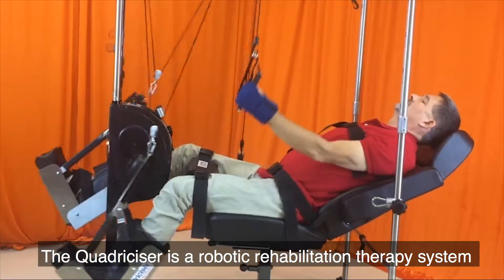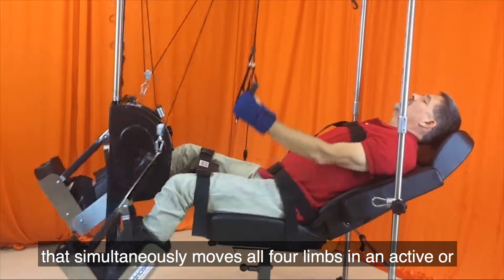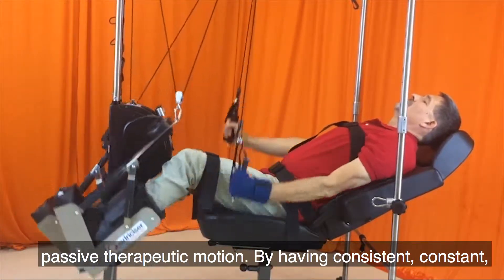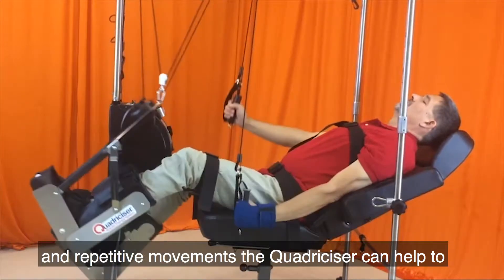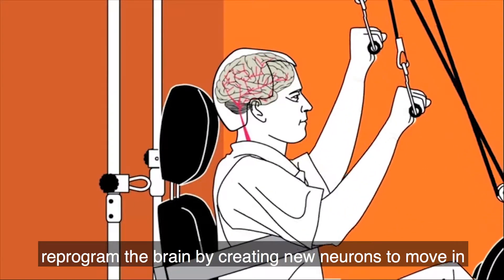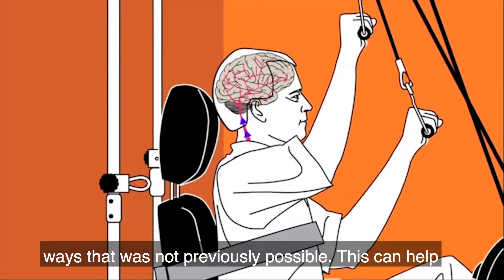The Quadriciser is a robotic rehabilitation therapy system that simultaneously moves all four limbs in an active or passive therapeutic motion. By having consistent, constant, and repetitive movements, the Quadriciser can help to reprogram the brain by creating new neurons to move in ways that was not previously possible.